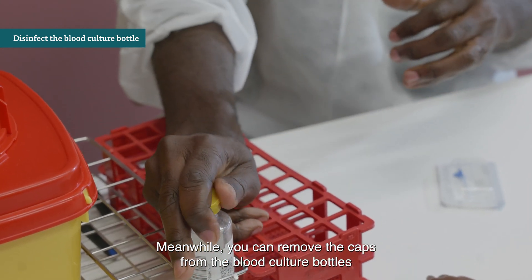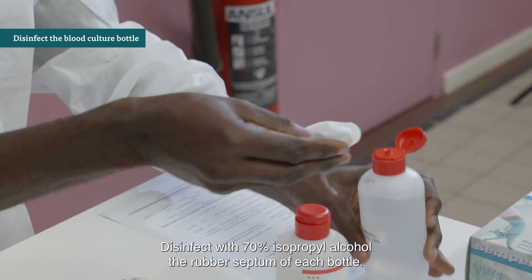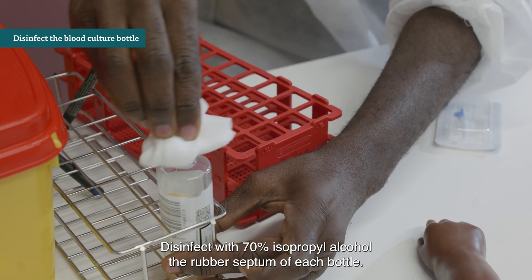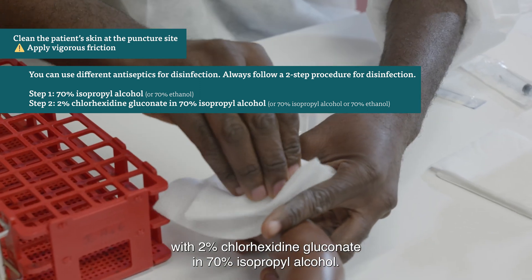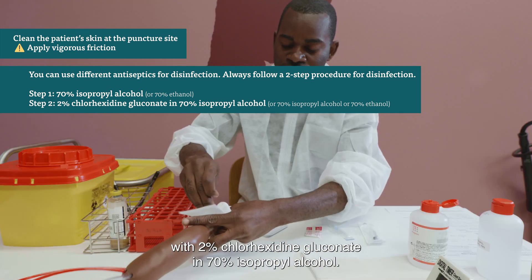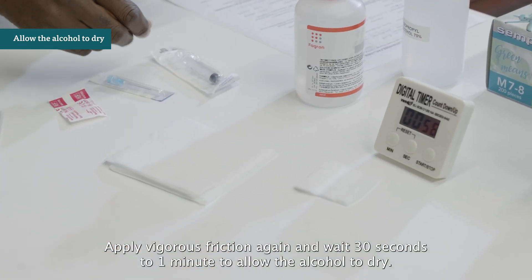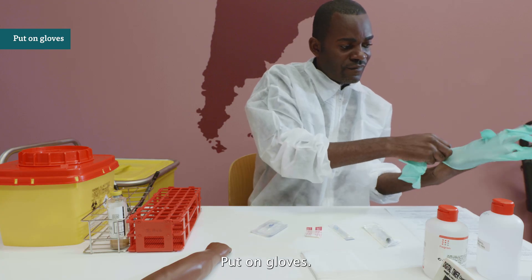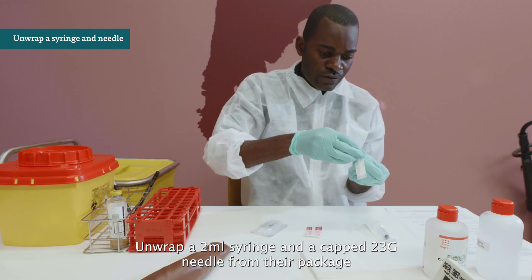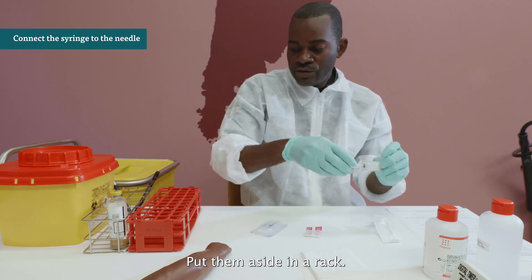Wait 30 seconds to one minute to allow the alcohol to dry. Meanwhile, remove the caps from the blood culture bottles and place the bottles in the rack. Disinfect with 70% isopropyl alcohol the rubber septum of each bottle. Now disinfect the puncture site again with 2% chlorhexidine gluconate in 70% isopropyl alcohol. Apply vigorous friction again and wait 30 seconds to one minute to allow the alcohol to dry. Do not touch the puncture site anymore during the rest of the procedure. Put on gloves. Unwrap a 2 ml syringe and a capped 23-gauge needle from their package, connect them in a sterile way, and put them aside in a rack.